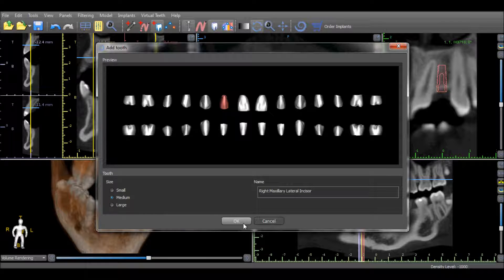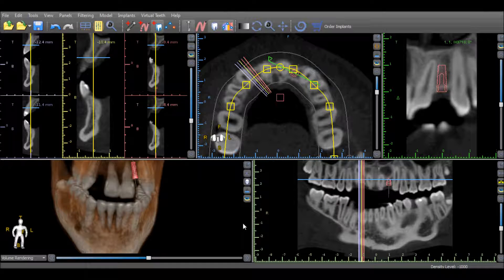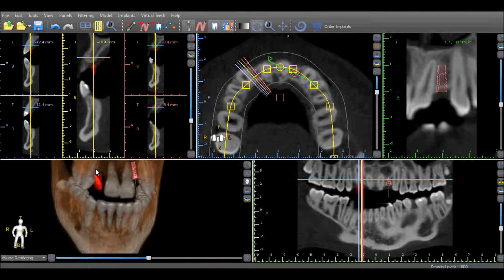Left-click in any view to place the virtual tooth in the desired location. The location can be modified by grabbing and dragging and moving it in any of the views, as well as rotating it and changing the angle in the 3D view.